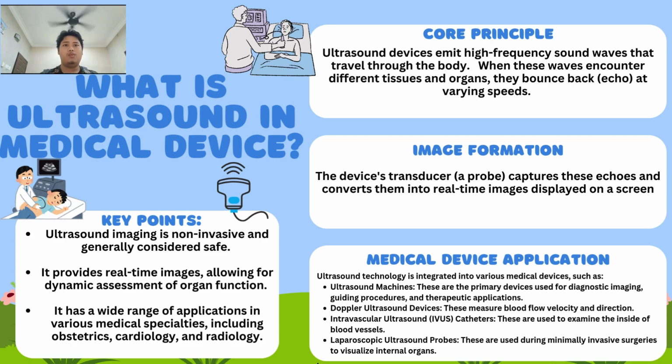What is ultrasound in a medical device? Here we break it down step by step. First, we go to the core principles. Ultrasound devices emit high frequency sound waves that travel through the body. When these waves encounter different tissues and organs, they bounce back like echoes at varying speeds.